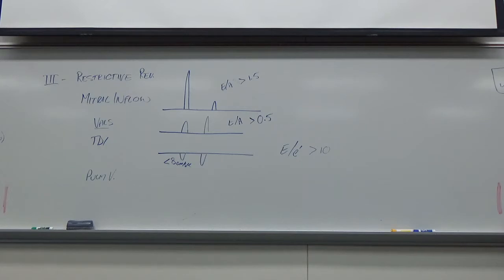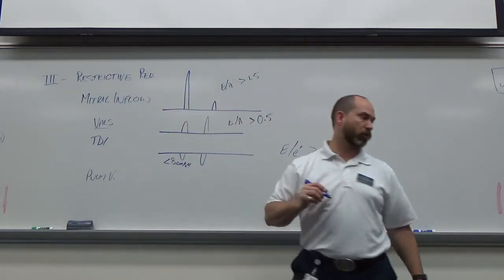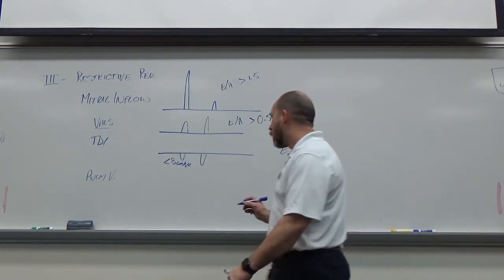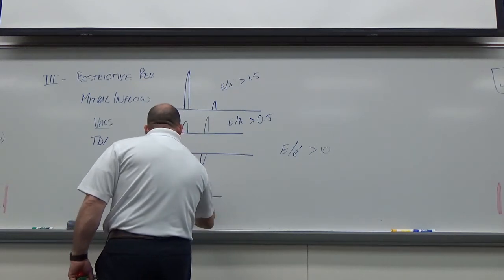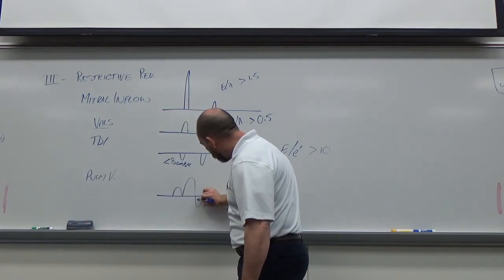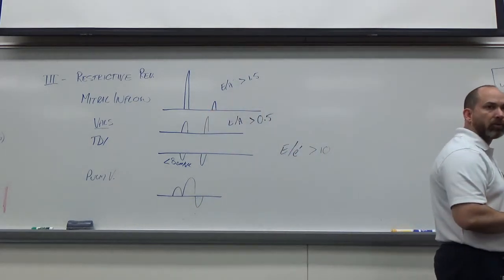All right, and then propagation velocity, just like the others, once we hit pseudonormal, is less than 45. Pulmonary veins. And the pulmonary vein A velocity was less, or I said, greater than 35. Yep. And what do my S and D look like on that? S is smaller. And D is bigger. And remember the A wave now, we just continually get bigger and wider. Okay, higher velocity and wider.